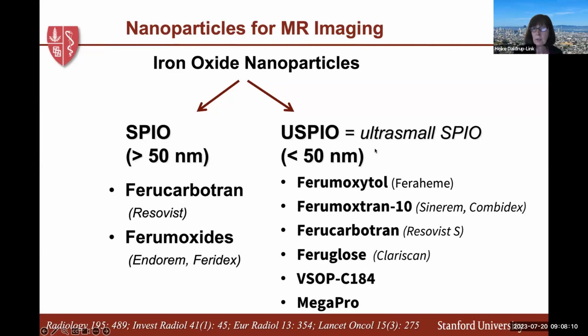And here are ultra-small iron oxide nanoparticles, which are preferred currently for a variety of reasons. They have a diameter of less than 50 nanometers. And here you see several compounds which all have been used in patients.